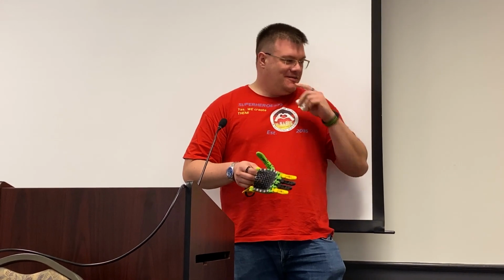And the fun is, back in the days, I found out that a guy like Da Vinci was right. The first time I used these forming tools, I used them on a 9-year-old girl. I measured their size, and then I created the forming tools. And then I was challenged to create a demonstration hand for the exhibitions with a handlebar. And I measured my hand and I figured out, okay, it's not 110% like the little girl, it's 190%.